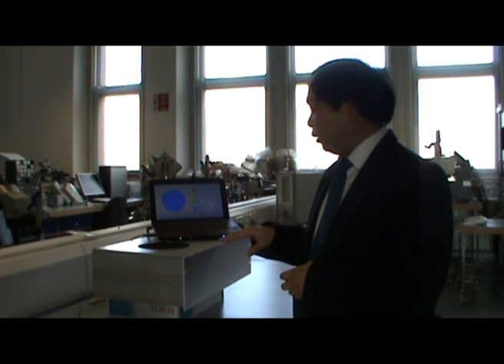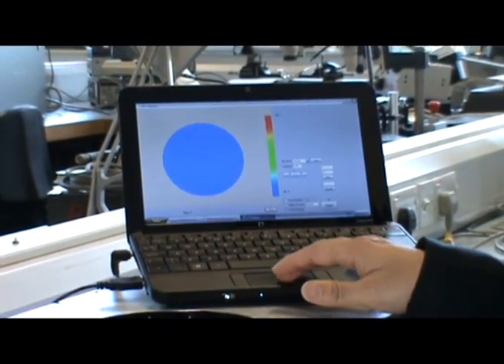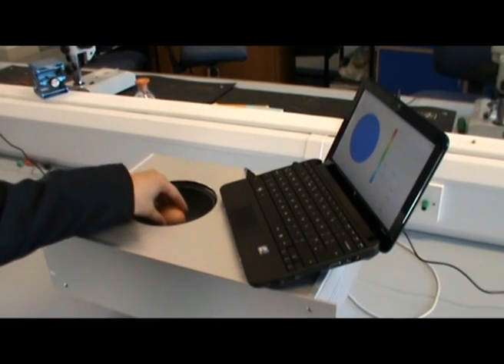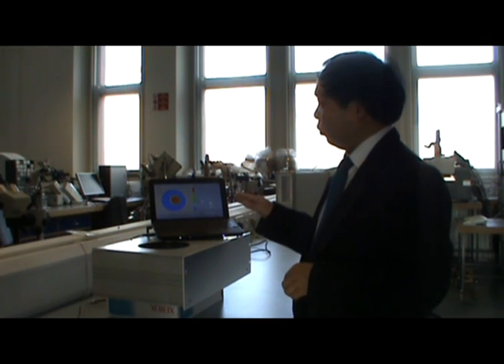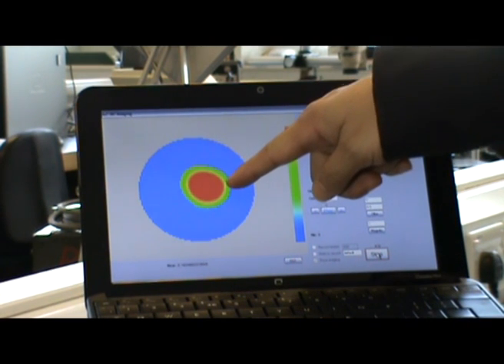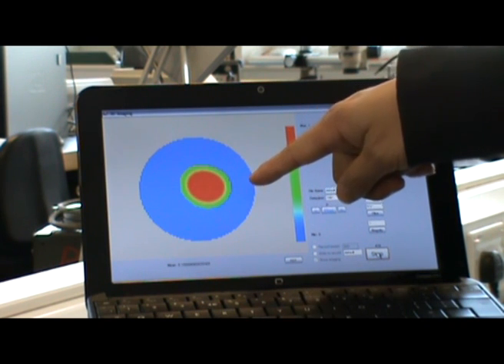At the moment, the imaging unit is empty. When I introduce an object that represents the tumor into the imaging unit, an image is shown immediately on the computer screen and the red dot represents the tumor in the breast.